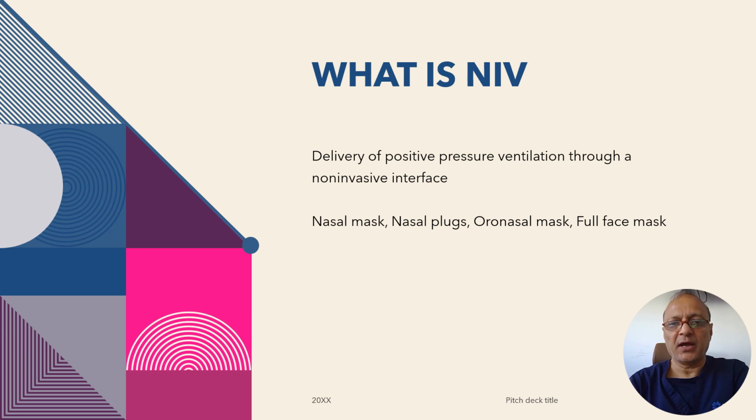So what is NIV? NIV is delivery of positive pressure ventilation, which is delivered by connecting a ventilator to a patient without an endotracheal tube or tracheal tube, but through various non-invasive devices, and these devices include nasal mask, nasal plugs, oronasal mask, full face mask or helmet devices.